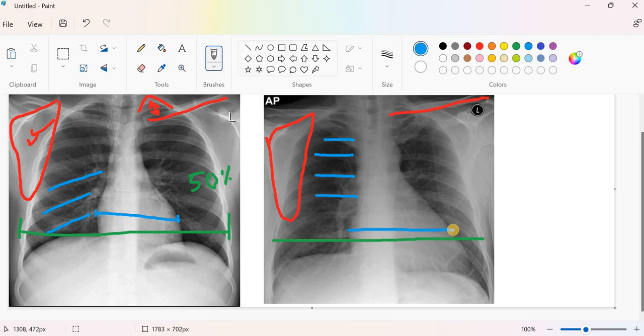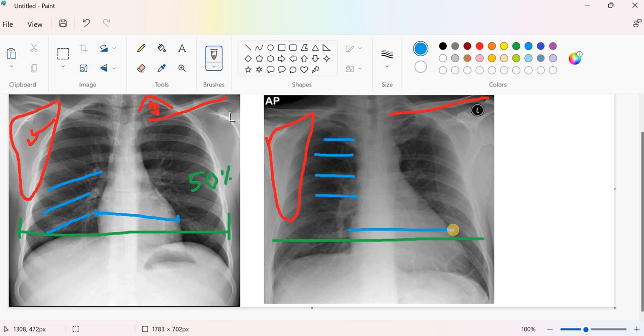Then look to the direction of the posterior ends of the ribs, if they are oblique or horizontal. And finally, to get sure from your identification, look to the comparison between the size of the heart and the transverse thoracic diameter. Thank you.